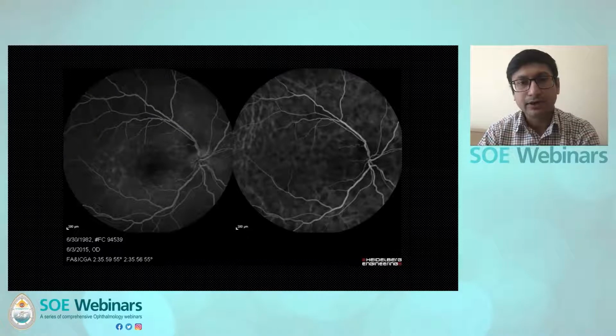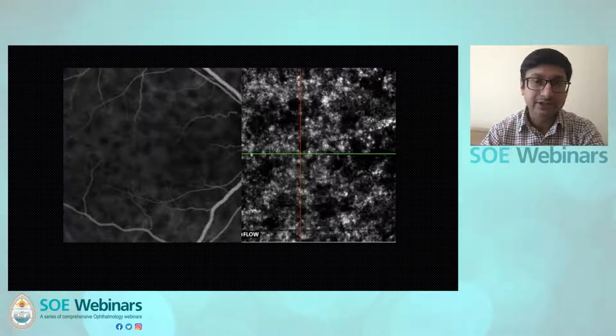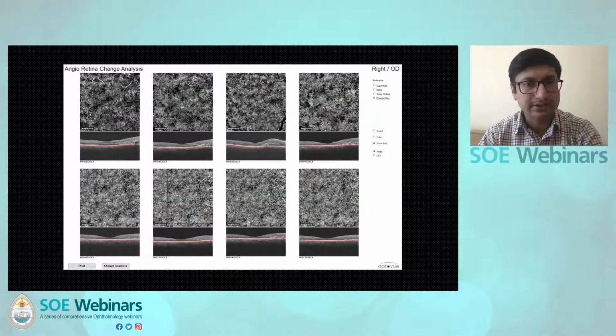Finally, choroidal imaging is very useful in patients of VKH, and you can see that you have choriocapillaris flow deficit, which exactly co-localize with the ICG, and you can actually use the OCT angiography along with ICG or even without, especially if you're doing a serial follow-up, and OCT angiography may be very useful just to look at the dark dots, if they're increasing or decreasing in size, and you can taper the therapy accordingly.